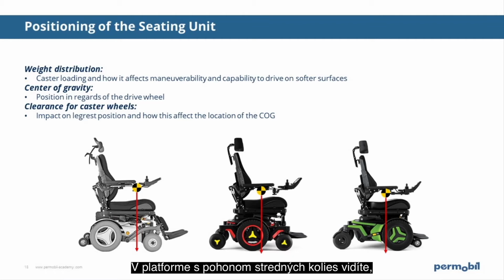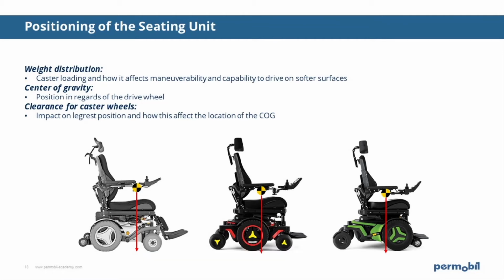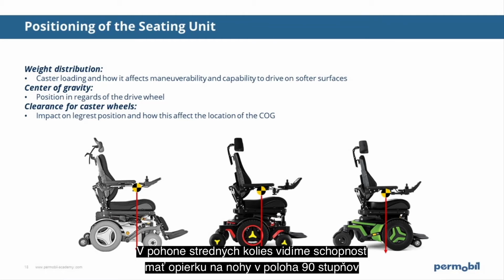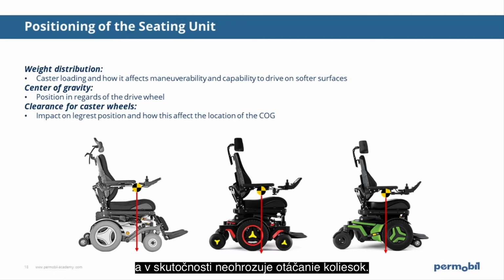In the mid-wheel driven platform, you see that this issue has been resolved by adding smaller caster wheels. So in a mid-wheel driven platform, we see the capability of having the leg rest at 90 degrees without compromising the pivoting caster wheel.